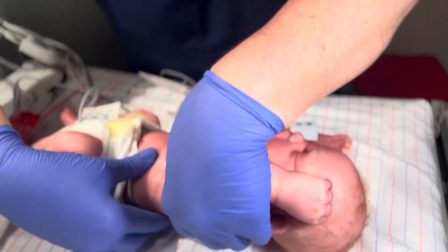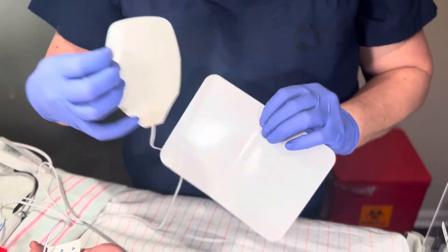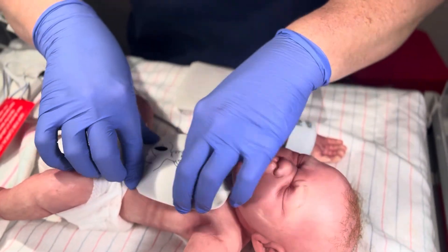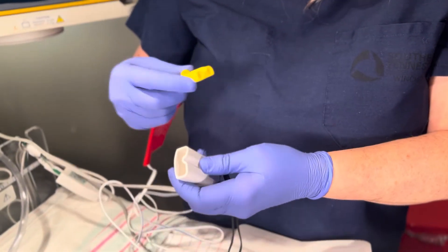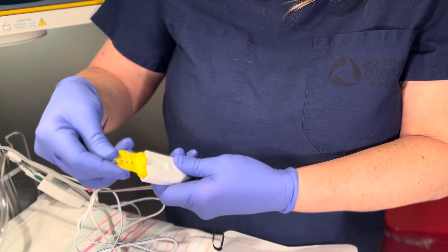Then simply roll the baby backwards. Now you'll apply the front pad by peeling and applying it firmly to the baby's chest as seen here. Now you're ready to connect the pads to the defibrillator via the quick combo connector. You simply connect as seen here.